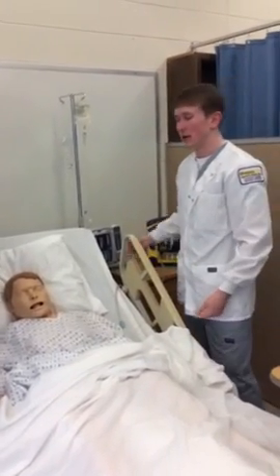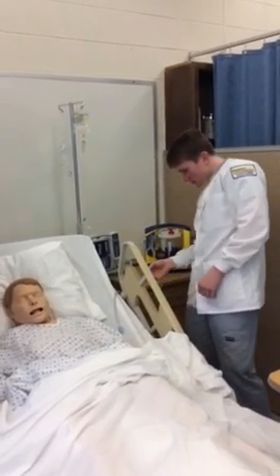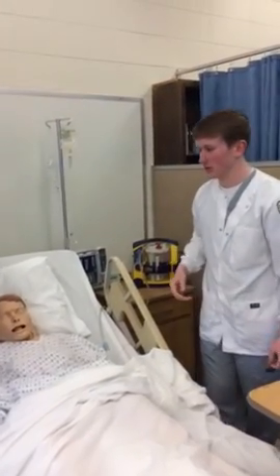Then the bed's already raised, but I would raise the bed to high Fowler's position, which you probably raise a little bit more. And should I say it? I'd say it's already high Fowler's.